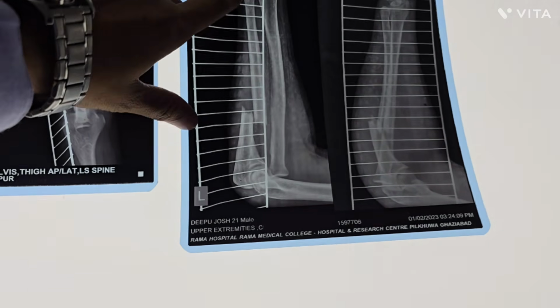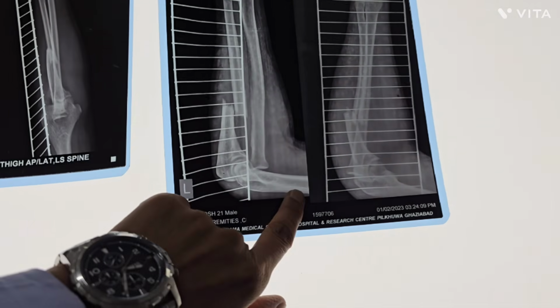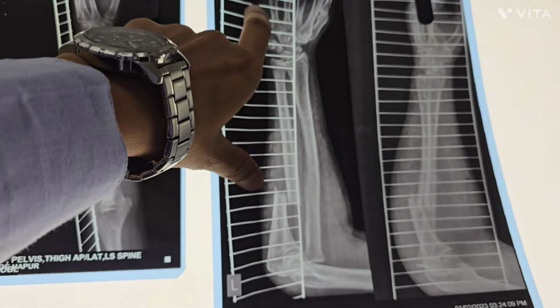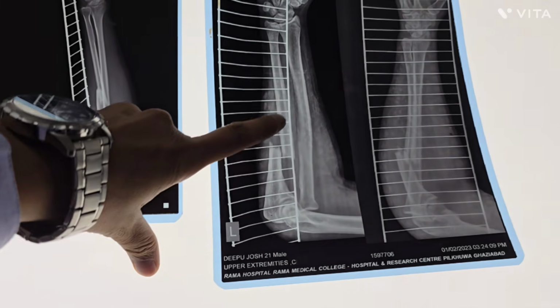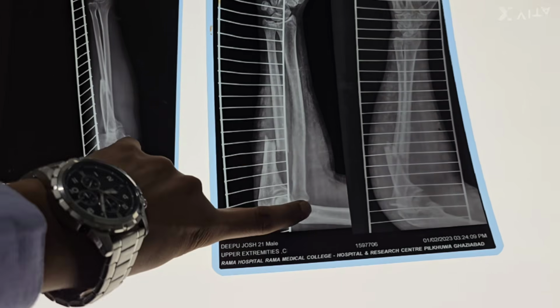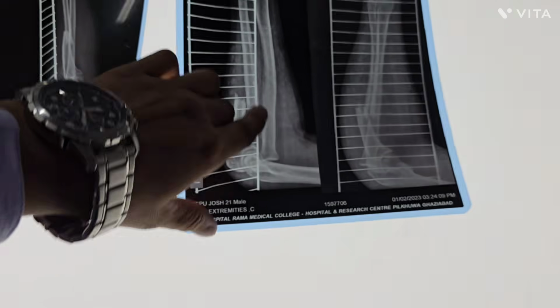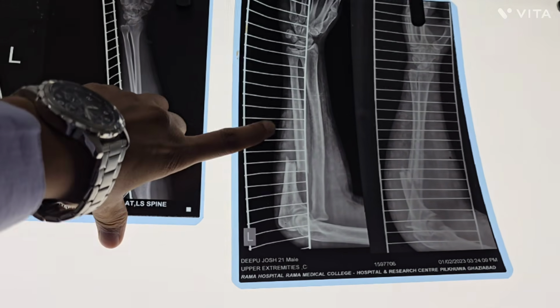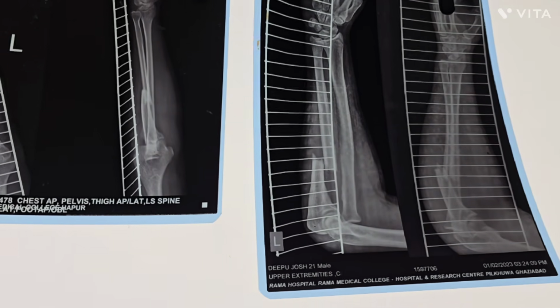Again you can see the ulna, and this one is the radius. This is the distal part of humerus, carpals and metacarpals. This ladder-like structure is a Kramer wire. So in this, the proximal 1/3 of ulna is fractured and the proximal radius, meaning the radial head, is dislocated, in lateral view, and this one is AP view. So what is the treatment? Open reduction, internal fixation with plate and reduction of the radial head.